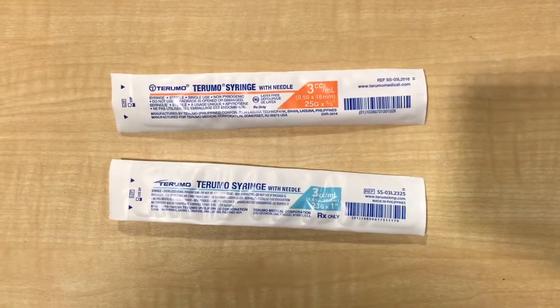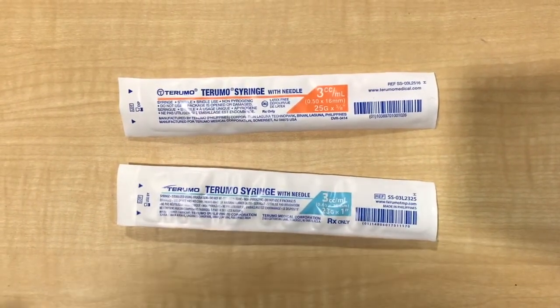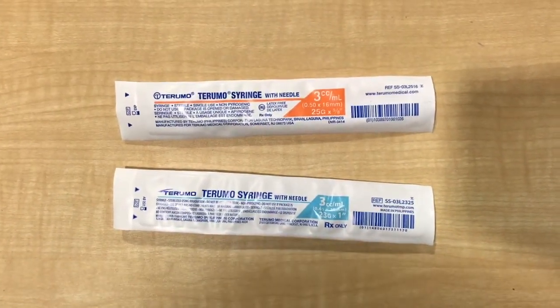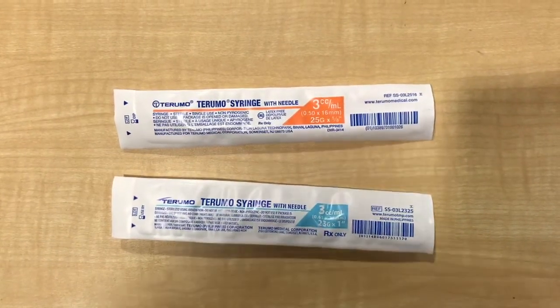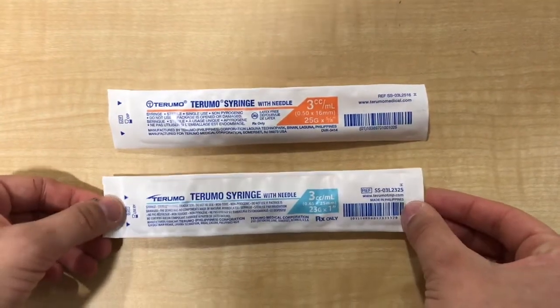So next in the injection process is picking your right syringe and needle. Because I'm going to be doing an intramuscular and a subcutaneous injection, I have 2 needles. Our first needle, we have a 23 gauge needle, and it's 1 inch.